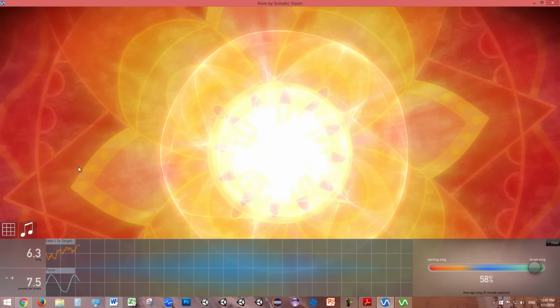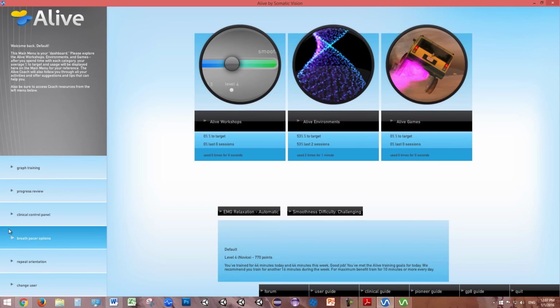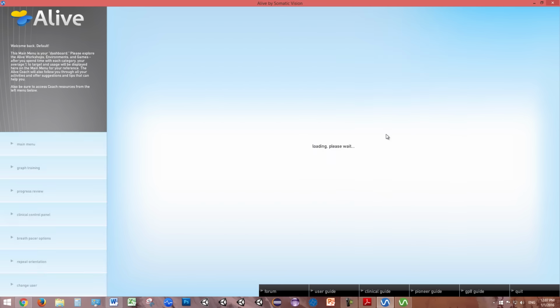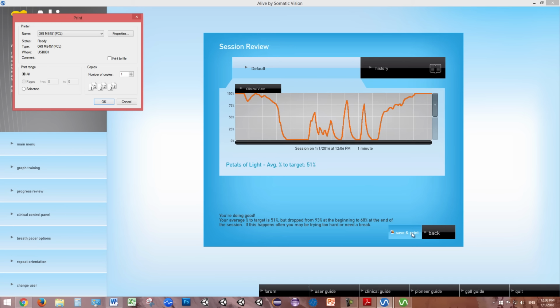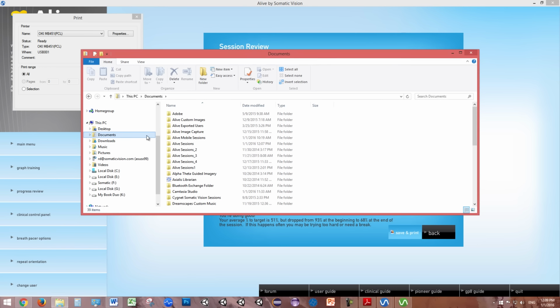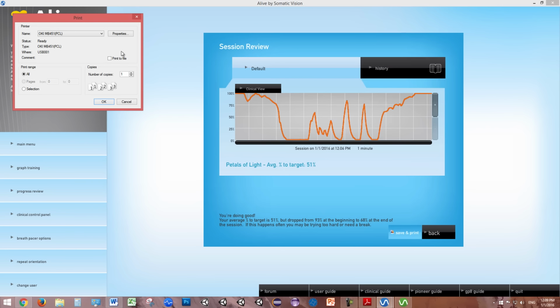When I'm finished training in this environment, I need to press this 9 squares main menu button to return to the main menu. I can now review progress using the Progress Review button. We can now review and print the session using the Save and Print button, or by simply pressing the letter P on your keyboard while in any graph training or review screen, or in the Alive menu. A screenshot is always saved to your Documents, Alive Image Capture folder under your username. After the image is saved, a print dialog opens, and you can press OK to print or Cancel to have only saved the screenshot.